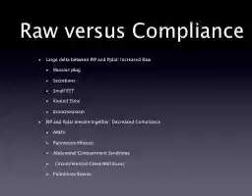We talk about a large delta between PIP and P-plat. We're talking about RAW, lots of things: mucus plug, secretions, small endotracheal tube, a kinked tube, bronchospasm. If the PIP and P-plat elevate together, this is a decreased compliance issue. We're talking about ARDS, pulmonary fibrosis, circumferential chest wall burns, pulmonary edema. With that, you could put large pulmonary infiltrates, abdominal compartment syndrome, and circumferential chest wall burns. I think I repeated myself a little bit there, but these are just some things that can cause elevated airway resistance versus decreased compliance.